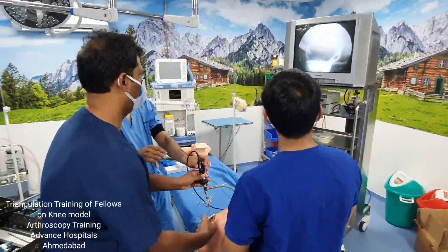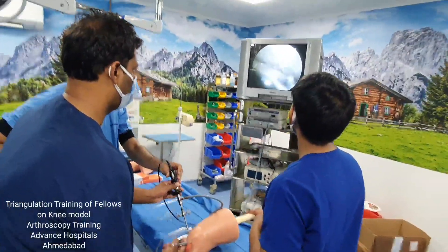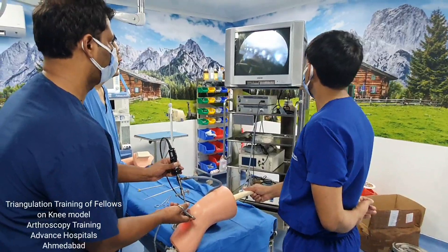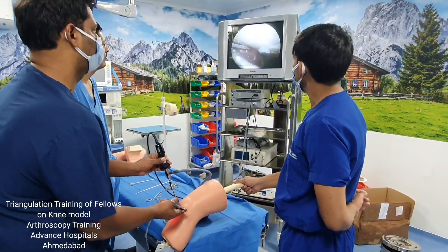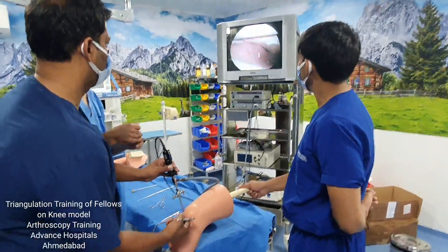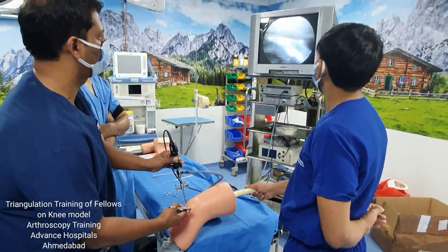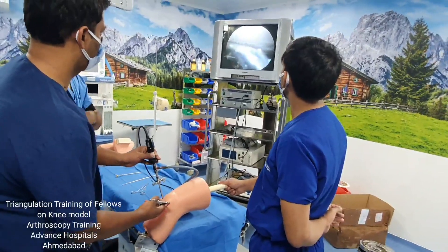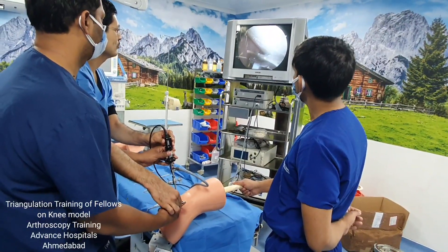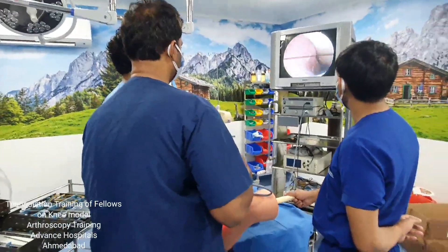Be gentle. Focus on the tip. Your eyes and your right and left hand should match each other. Do small, gentle movements — very small movements. This is a small plastic piece; if you want to take that off, you have grabbed it nicely, so just hold it and take it out. Close the grasper and pull it. You have nicely pulled out the loose body from there — this is how you keep your eyes and hands coordinated.